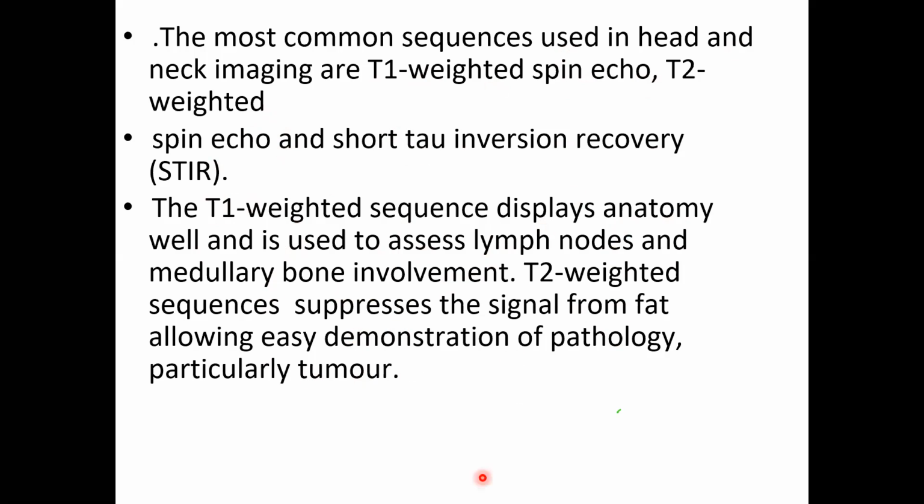So you should be keeping in mind one very important thing: T1 weighted and T2 weighted, and short tau inversion recovery. So T1 weighted spin echo, T2 weighted spin echo and short tau inversion recovery. It is called a STIR sequence.